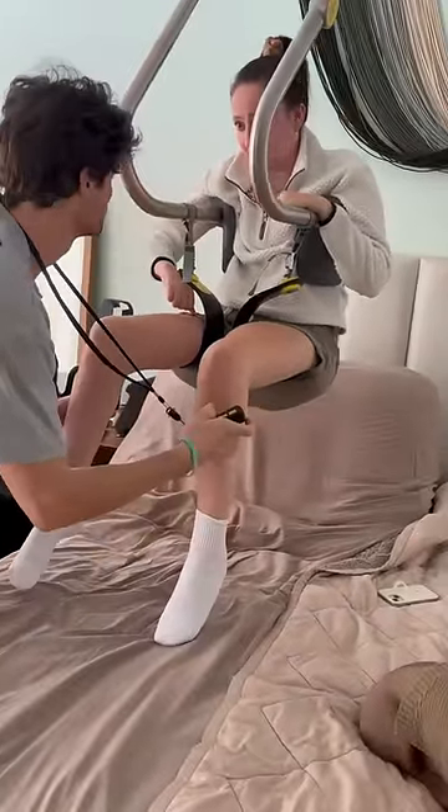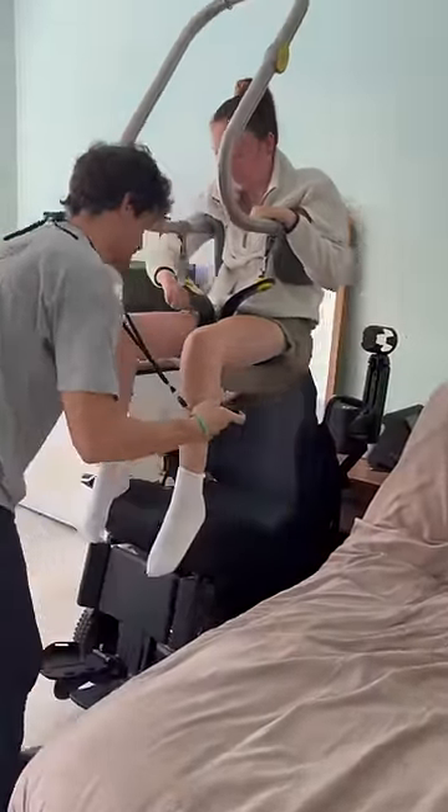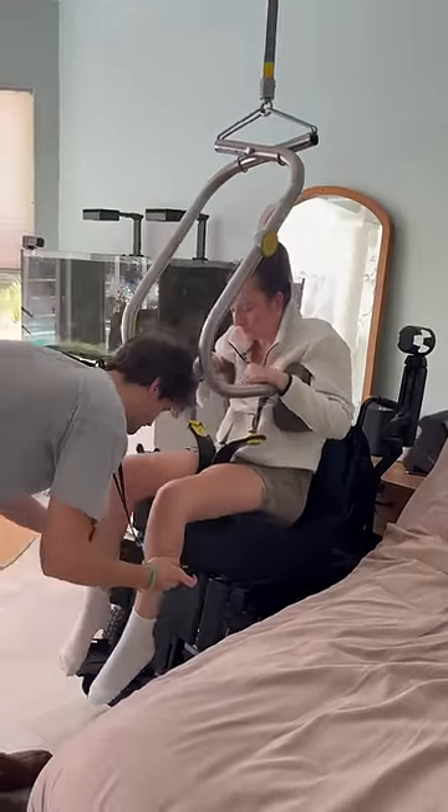I'm such a baby when I'm up high — I get nervous — but it's honestly so safe and you can't fall out. A lot of people are asking if you can fall backwards, but you really really can't.